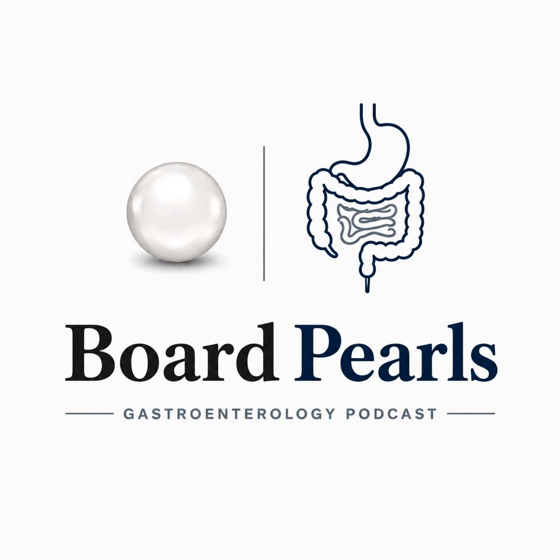Persistent fever, persistent leukocytosis, persistent solid debris on imaging. The cavity tells you whether it is emptying. Dwell time has its own reasoning. After walled-off necrosis drainage, you typically reassess and remove the LAMS at about 4 weeks, with 4 to 8 weeks as the acceptable range. That timing is guided by clinical and imaging resolution rather than a fixed calendar date. Pull it too early, and the tract collapses before the cavity has finished draining.